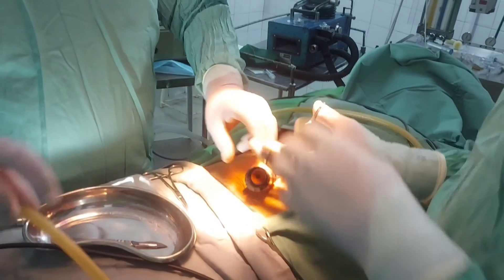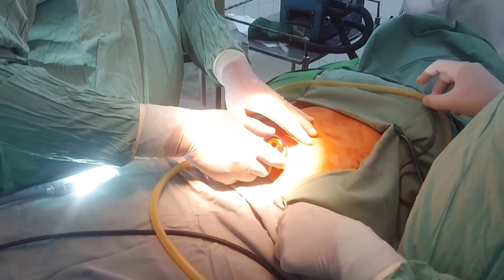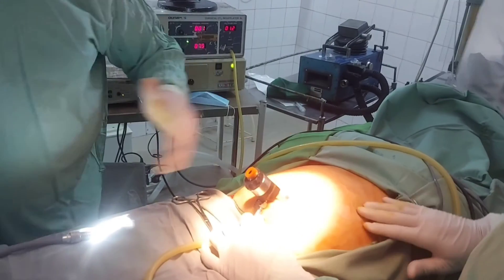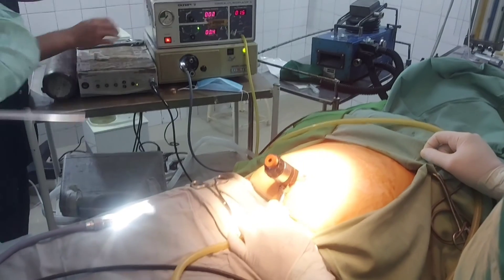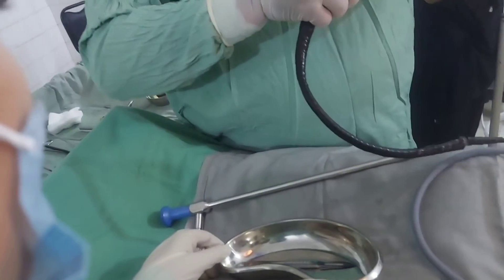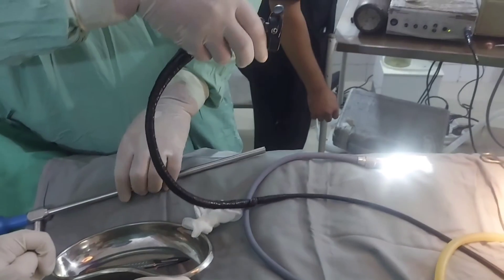For pneumoperitoneum, open technique is used and a Hassan trocar is passed. A blunt trocar is used to insert the 10 to 11 millimeter cannula as the optical or camera port. Operating pressure for pneumoperitoneum should be around 12 to 14 millimeters of mercury. Gas port is attached, pneumoperitoneum is created and checked by tympanitic sound. The camera port is passed in the supra- or infra-umbilical position as indicated, and the laparoscope is then attached to the monitor.